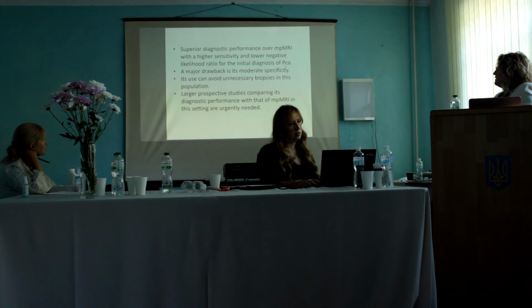The present meta-analysis shows a superior diagnostic performance over multiparametric MRI, with a higher sensitivity and lower negative likelihood ratio for the initial diagnosis of prostate cancer. A major drawback is moderate specificity. Its use can avoid unnecessary biopsy in this population. Larger prospective studies comparing its diagnostic performance with that of multiparametric MRI in these settings are urgently needed.